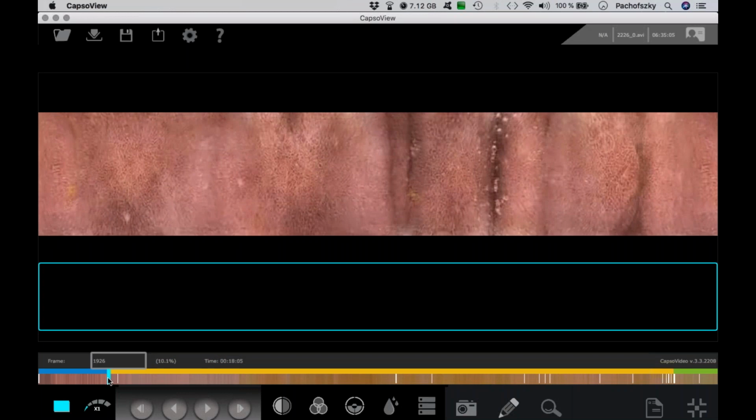Thank you. I think it's 10:30 Eastern time, Dr. Pachofszky, and we are well ahead of the time. So we are coming to the end of the session, and if there is no further questions, there's one more question which has just come up. It is difficult to discriminate between jejunum and ileum as there is no landmark. Do you have any tips for this? Dr. Pachofszky, one question, last question.